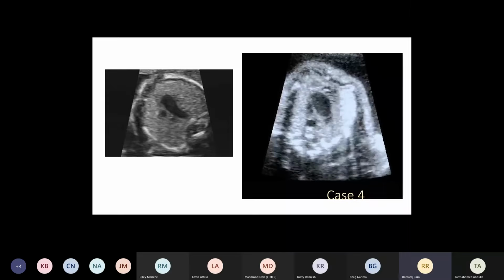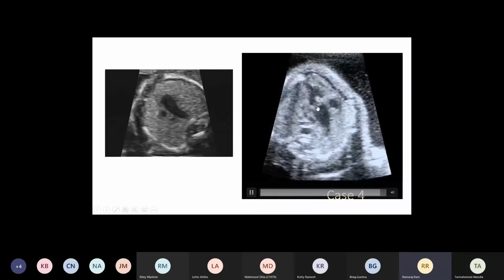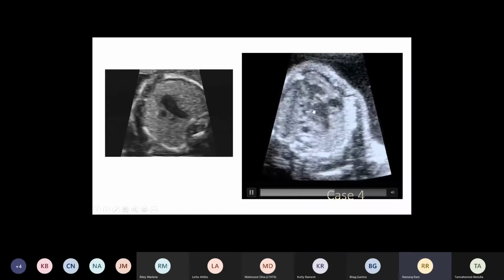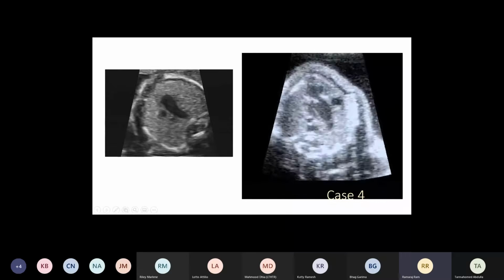What you're seeing there is an overriding vessel with a thick outflow tract valve. And again, if you carefully look at it, next to the outflow valve there is a pulmonary artery which is starting, to about the 9 o'clock position. So that raises the suspicion of truncus in this scenario.